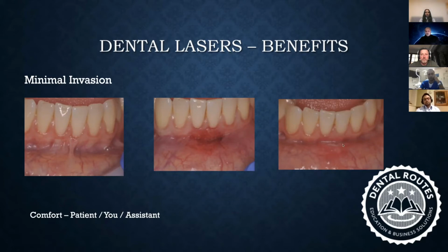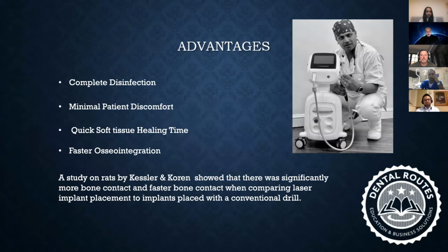All right. So these kinds of additional adjuvant treatment, or say for instance, there was a bit of excessive gum growth up there. It takes you 10 minutes to just sculpt the gum away. Okay, so that's the additional benefit of you having the laser by your side while you're doing treatments related to dental implants.